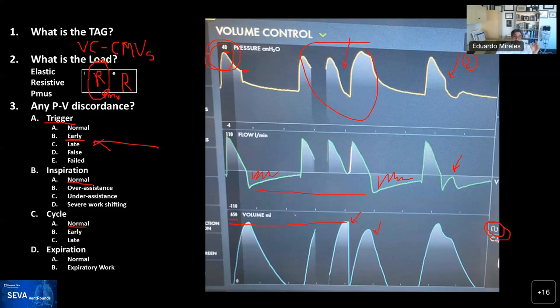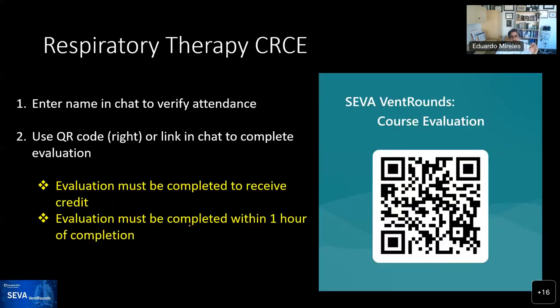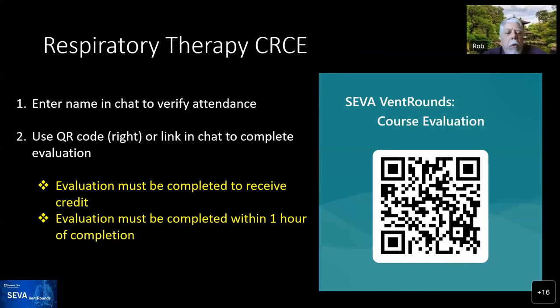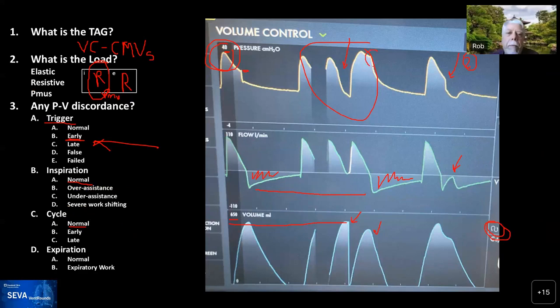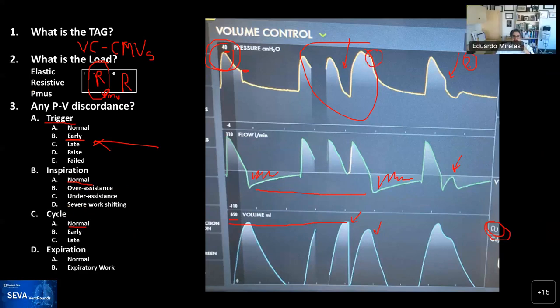Rob: Also notice the plateau pressure was almost double too, which indicates you have almost double the tidal volume. So this is the plateau pressure for the first breath compared with the double breath — it looks to be about double. The key finding for this patient is increased resistance, and with early trigger producing a double breath, the amount of air inside this patient is dangerously excessive.